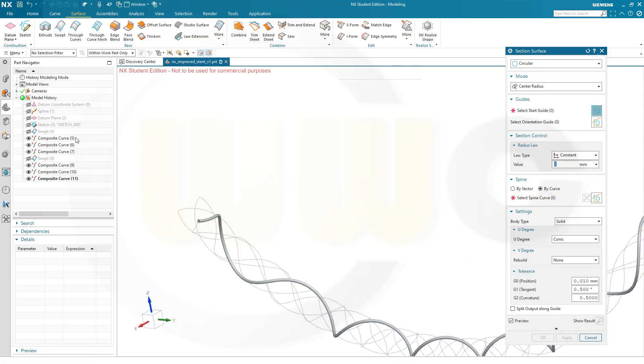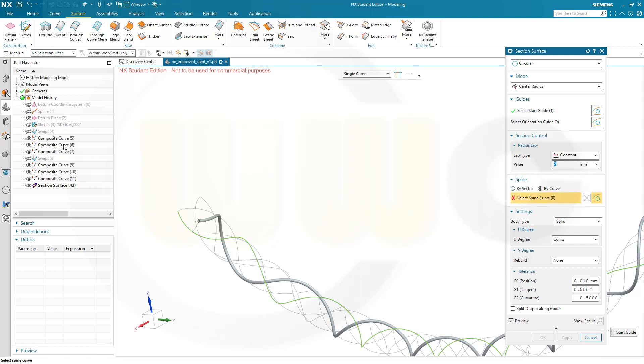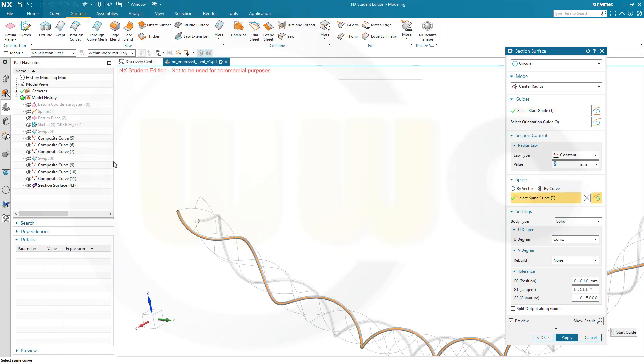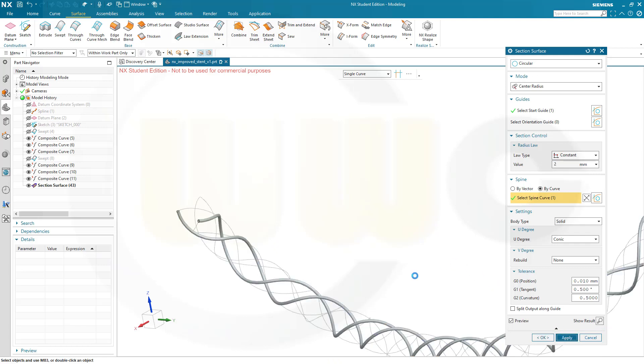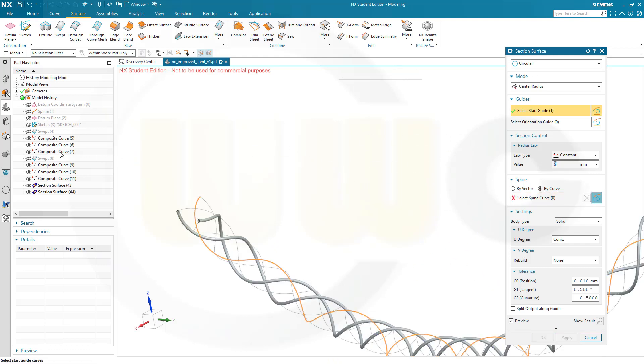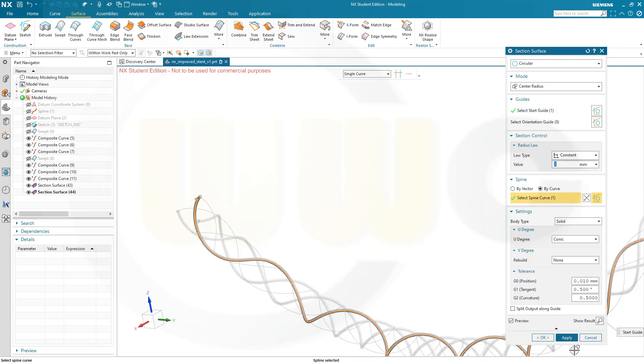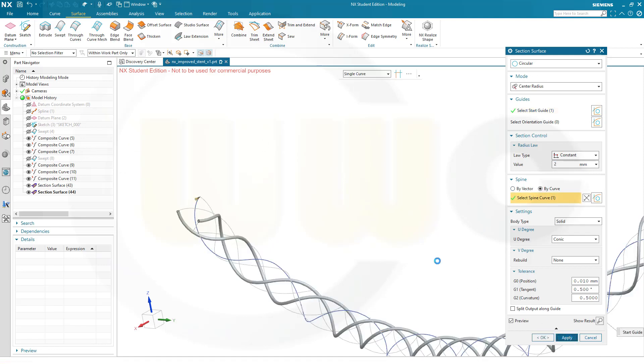Use the next one, same radius. Select spine curve, apply. Then select the third curve, select spine curve, apply.